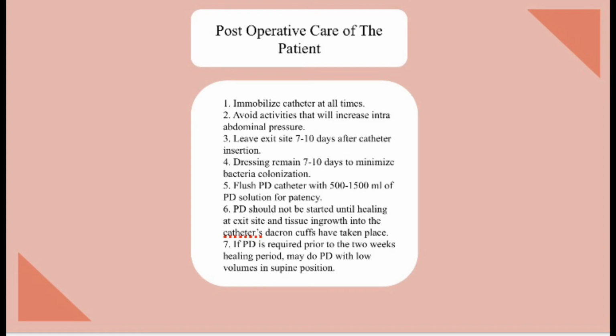Post-operative care of the patient. Catheters should be immobilized at all times to prevent trauma. Avoid activities that will increase intra-abdominal pressure like coughing, straining with stool, bending over, squatting, or stair climbing. Leave the exit site dressing in place for 7 to 10 days after insertion of the catheter, to minimize bacterial colonization during the healing period.